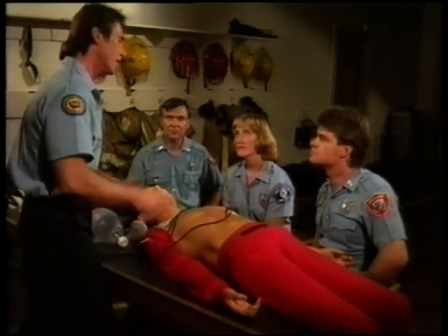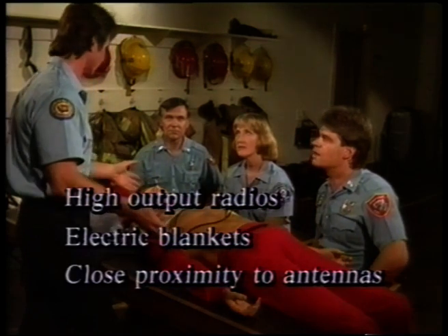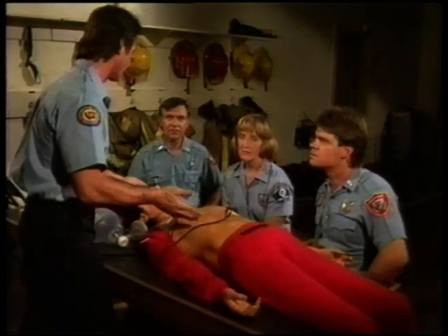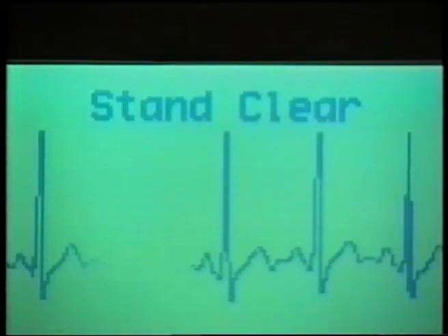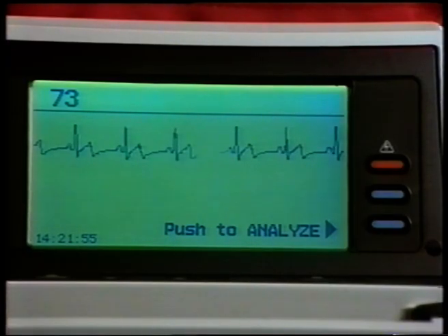If a patient is being transported in a vehicle, stop the vehicle prior to pushing the Push to Analyze button. If patient motion is ruled out, check for and reduce, if possible, sources of radio frequency interference, such as high output radios, electric blankets, or close proximity to antennas. If motion occurs for less than 20 seconds, the LIFEPAK 300 automatically resumes analysis once motion subsides. However, if motion occurs for more than 20 seconds, the device will revert back to the Push to Analyze screen.